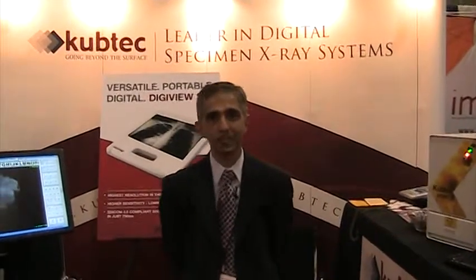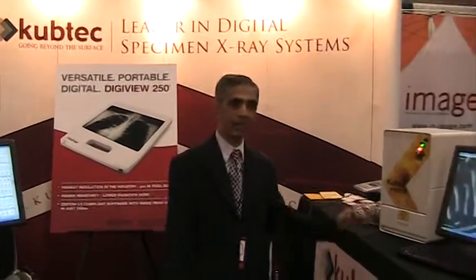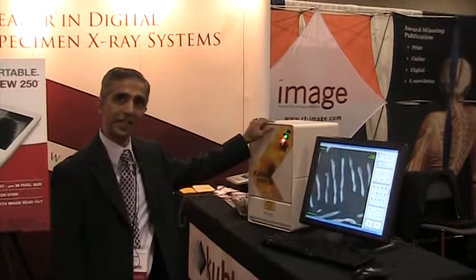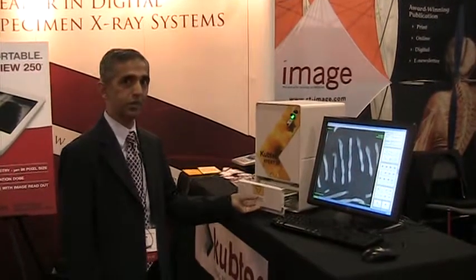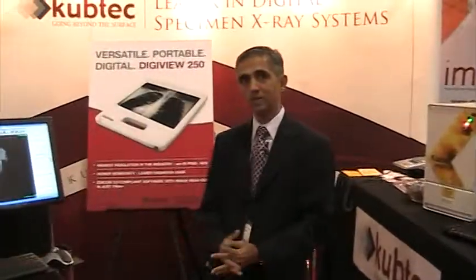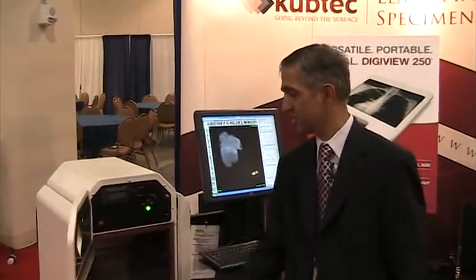Hi, my name is Vikram Bhutani and I'm with Kubtec. This year at AHRA we are presenting our line of specimen x-ray systems: the Expert 20, which is primarily designed for imaging biopsy cores, and the Expert 40, which has been designed for imaging cores and surgically excised breast tissue.